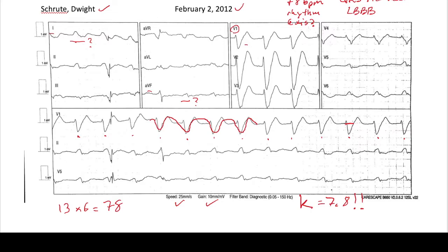In hyperkalemia, you can also see peaked T waves, and patients can also develop AV blocks. So this is a patient with a potassium of 7.8 who is starting to develop sine waves.